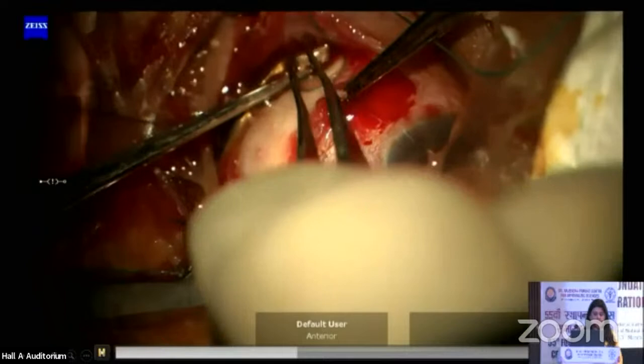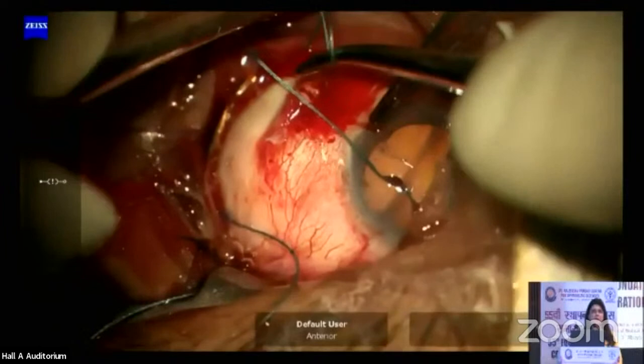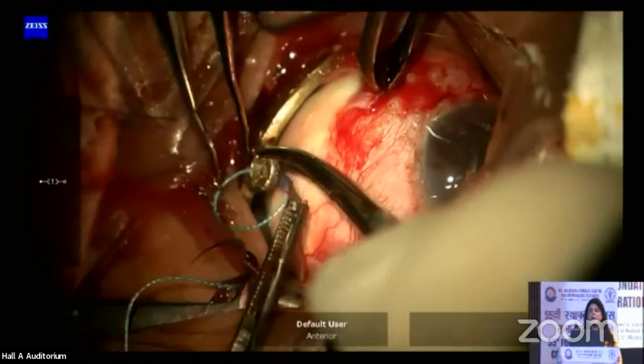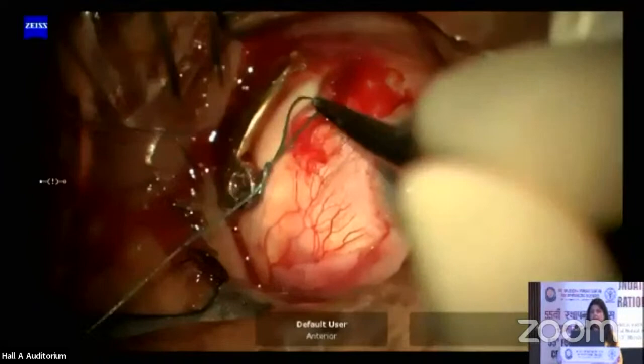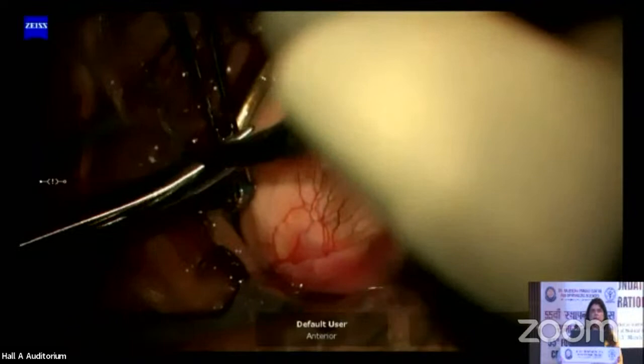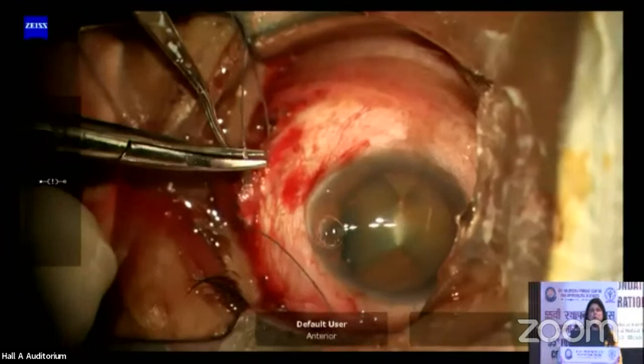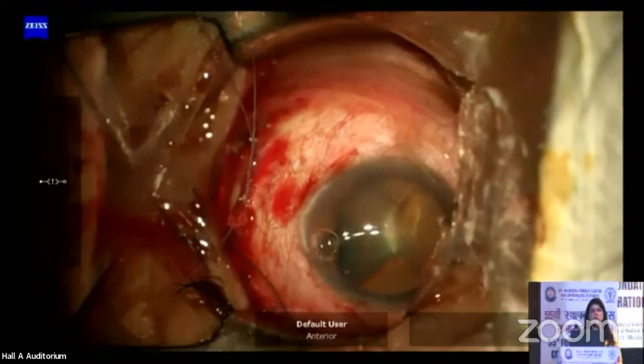So now moving on with the surgery, you can see that the sutures are being tied. This is a radioactive plaque, as I told you. Now this is being anchored nicely, and you can see the anterior edge of the plaque. This plaque is about 21 millimeters in diameter. So it is going right up to the back of the eye, and it is able to cover the area of the choroidal melanoma completely. As I told you, the dimensions of the choroidal melanoma were around 10 millimeters in basal diameter. Therefore this plaque is nicely covering all of it, so that the whole tumor can receive the desired radiation dose.